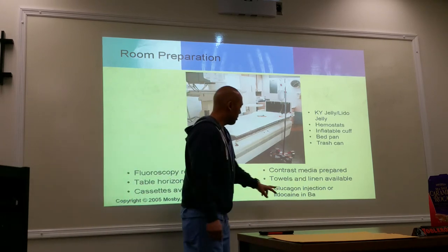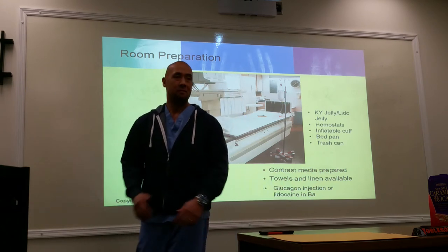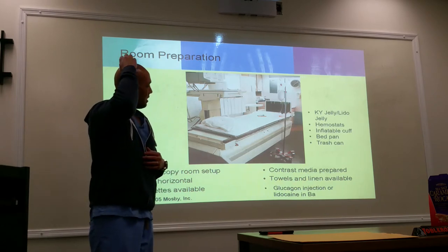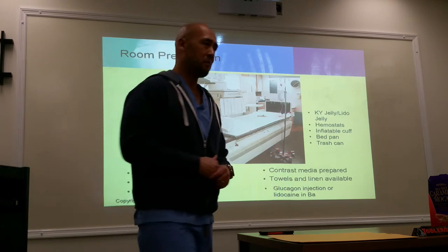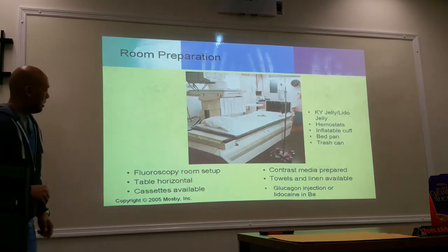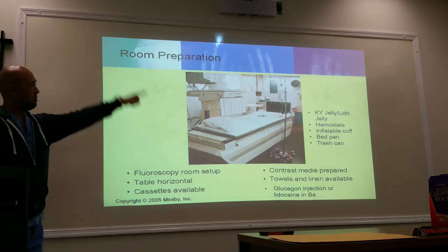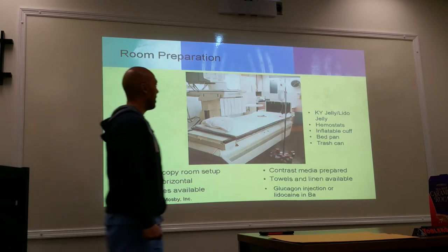Sometimes what they'll also do is mix lidocaine inside the barium. The doctor will let you know if you need to do that or not, but it does help numb up, anesthetize the lining of the bowels when performing a barium enema. You also need an IV pole. Have an IV pole ready to hang your enema bag.